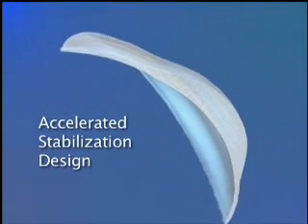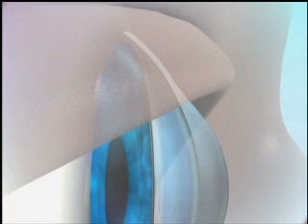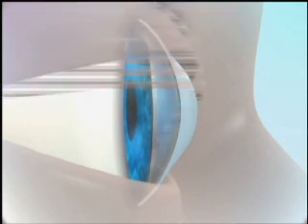What makes accelerated stabilisation design, or ASD, so different is the shape of the lens. The ASD design is uniformly thin around the lens edge. This is the area that rests underneath the top and bottom eyelids. Conversely, there are small zones of thickness in the area of the lens that sit between the lids.